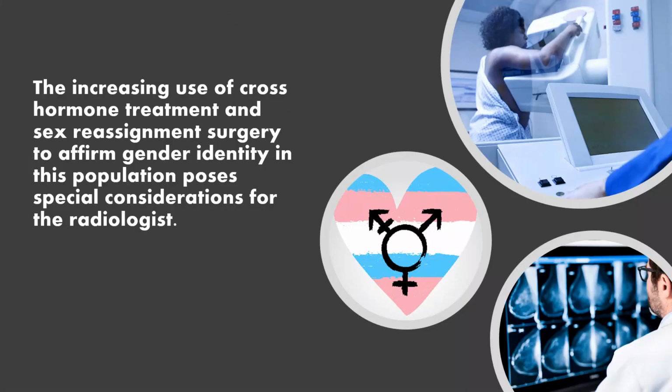Another significant challenge for the mammographer is the transgender patient. Transgender patients may be male or female and have additive or subtractive types of modifications to their body. This makes it very difficult for the mammographer. The changes in the body in the transgender patient make it difficult to analyze technique and position.